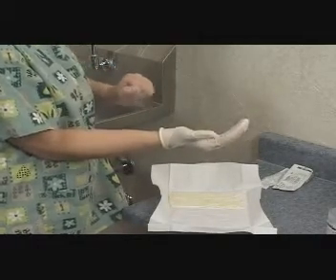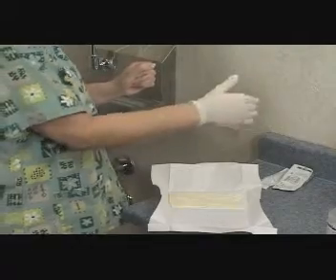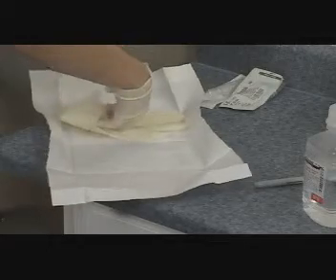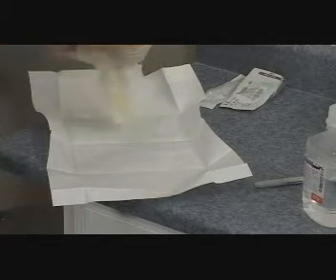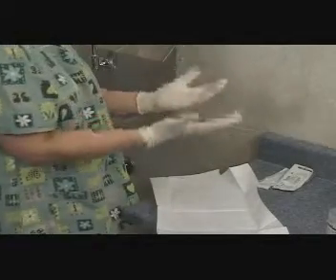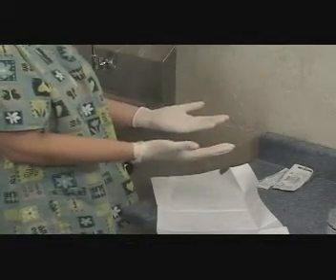Then, with her gloved hand, she inserts her fingers under the cuff of the second glove. With her thumb against her palm, she inserts her non-dominant hand into the glove and gently pulls the glove onto her hand. She keeps the thumb of her dominant hand as far from the palm as possible when putting on the second glove. Now let's suppose that the closed gloving technique is required.